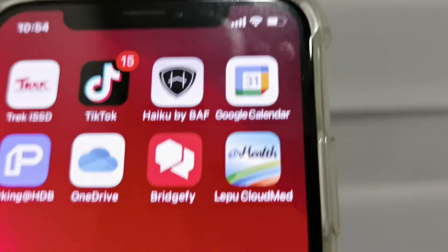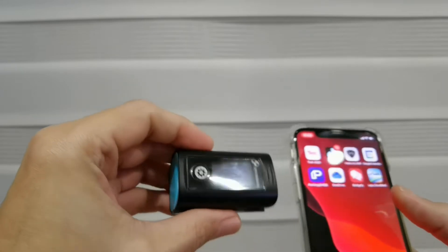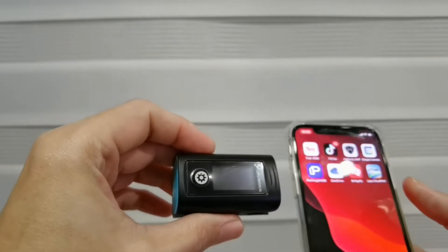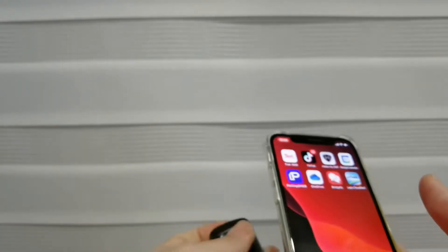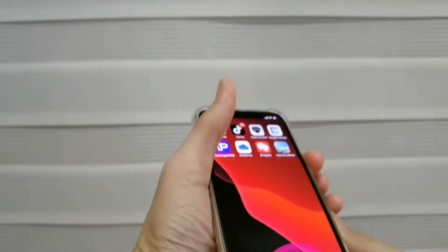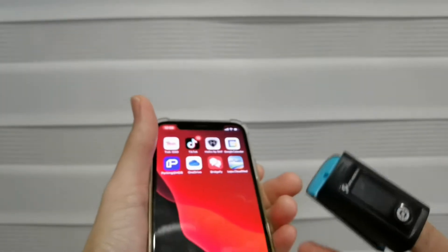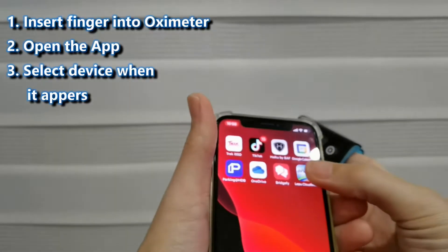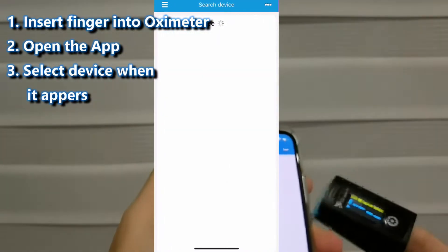The app is called 'App Health.' It is very simple to use. I actually tried a few times and didn't realize it was so simple. What you do is put the oximeter on your finger and turn it on, and it will be able to detect the device.